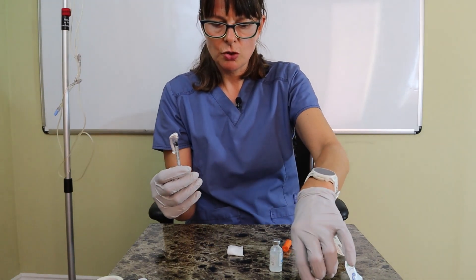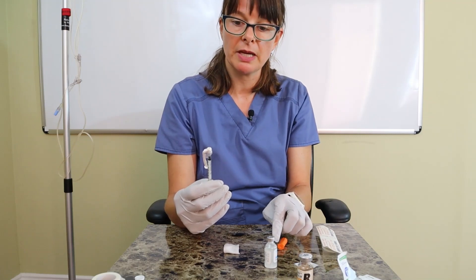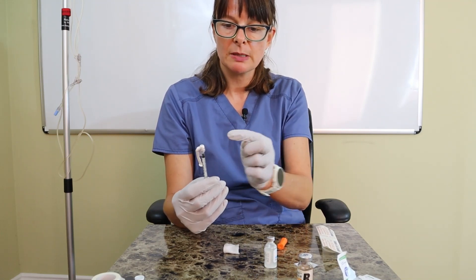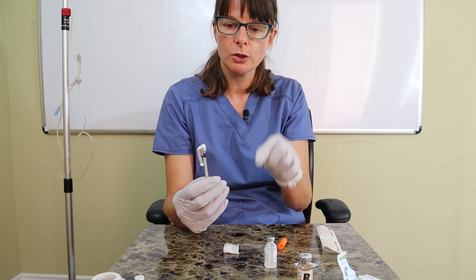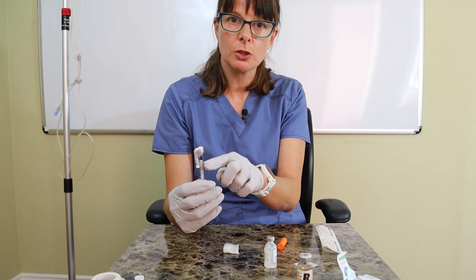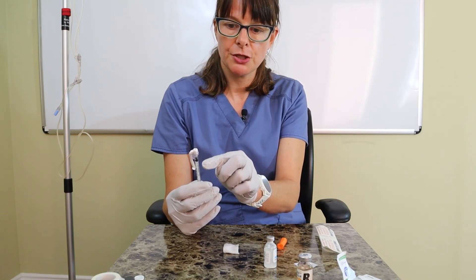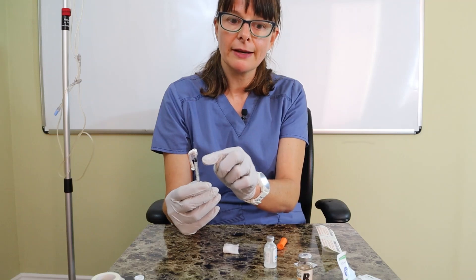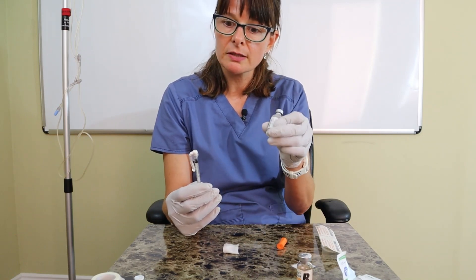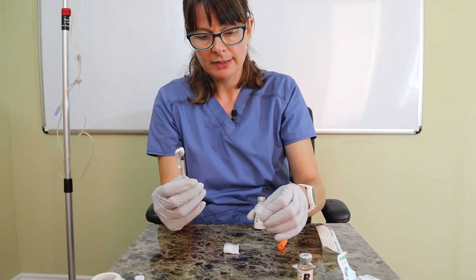Now I need to draw up the NPH. I have to be very careful not to push any regular insulin into the NPH vial. I cannot draw back on the plunger once the needle is in the NPH vial or draw up vigorously, because turbulence might let fluid flow back. I need to do this very slowly and only go to the 15-unit mark, giving me a total of 5 units regular and 10 units NPH. If I go past 10 units of NPH, I'd have to discard the syringe and start over.